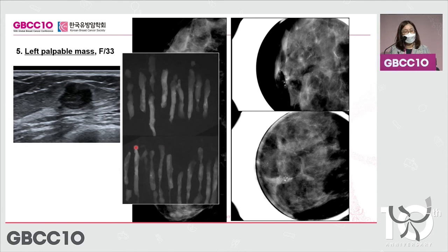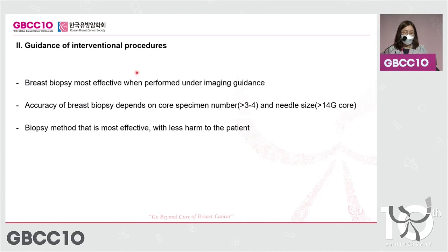So in some instances, some patients say that I just want to do an ultrasound and not a mammogram because it hurts so much. And I did this 2 years back, and they told me that I had a dense breast. So in some instances, the patients want just an ultrasound. But in some instances, like this case, this small microcalcification is not seen on ultrasound. So in order to find more or characterize this better, we need both.